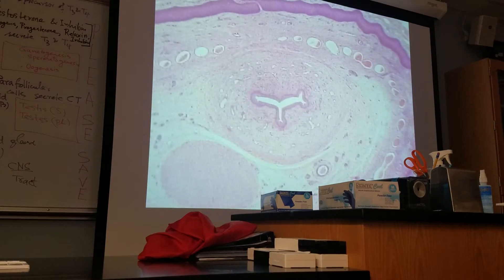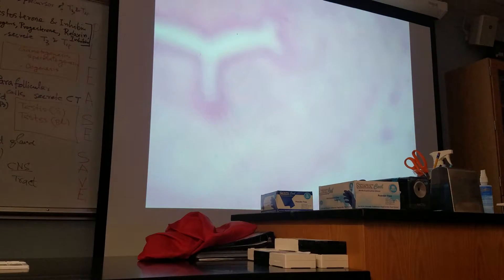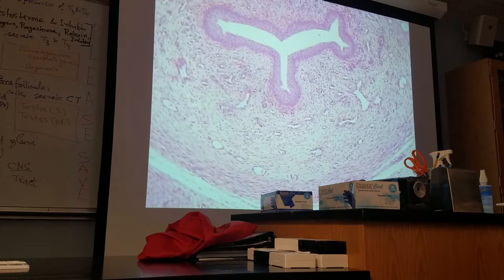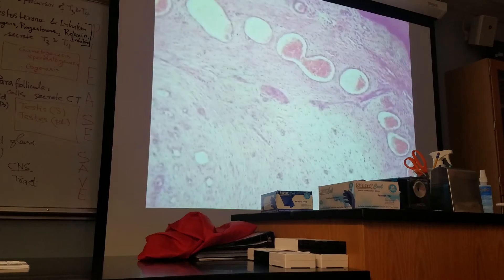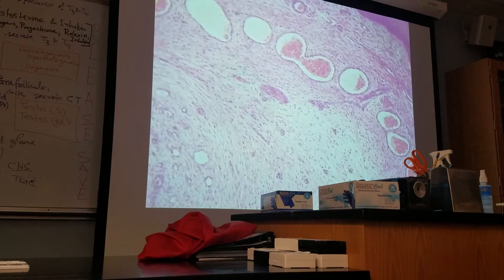If you look at the epithelium of the urethra, it is stratified columnar epithelium — this is the urethra. You can look at the blood vessels in the corpus spongiosum; this is erectile tissue, and you can still see some red blood cells.